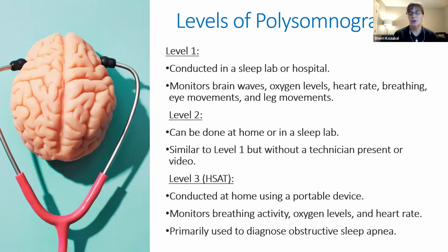And this is in an effort to determine, in essence, is the person moving through the sleep stages and the sleep cycles like we expect them to? And if they're not, what is waking them up? This is why we gear them up in every level, so we can capture all the different ways that we know that sleep can be disturbed, whether it's through movements or breathing and such, which I'll get into in a little bit.